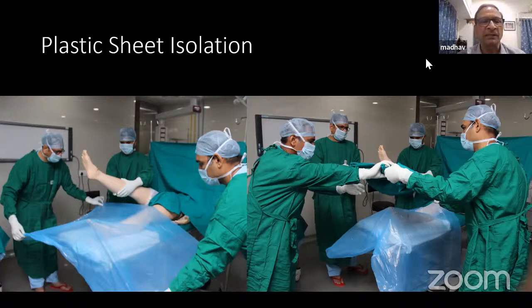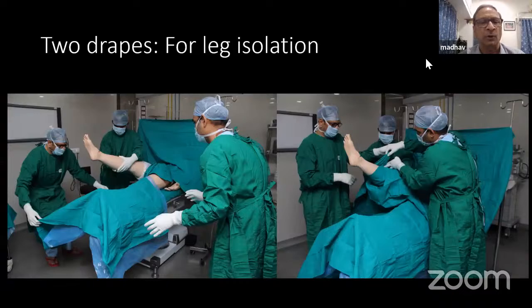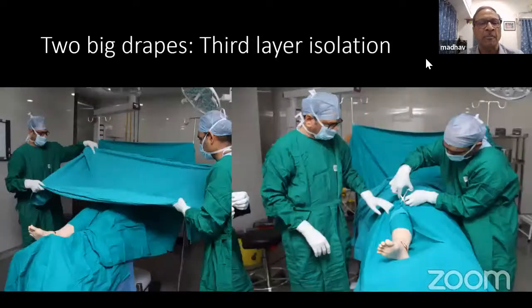Now what I'm going to describe is the draping of a lower limb surgery, either the part which is to be operated is below knee, foot and ankle, or knee and the thigh. The patient here is in a supine position. The anesthetized patient is kept in the supine position.